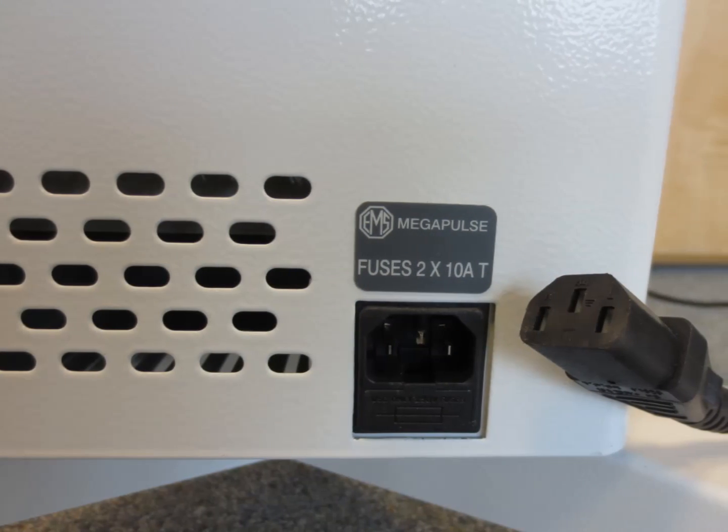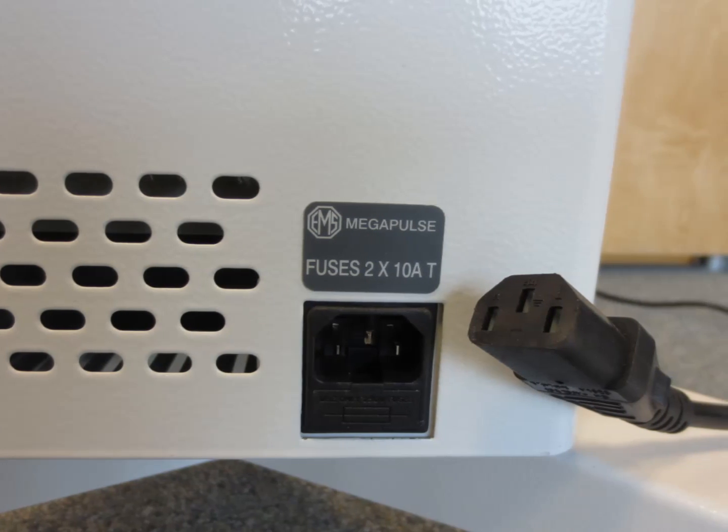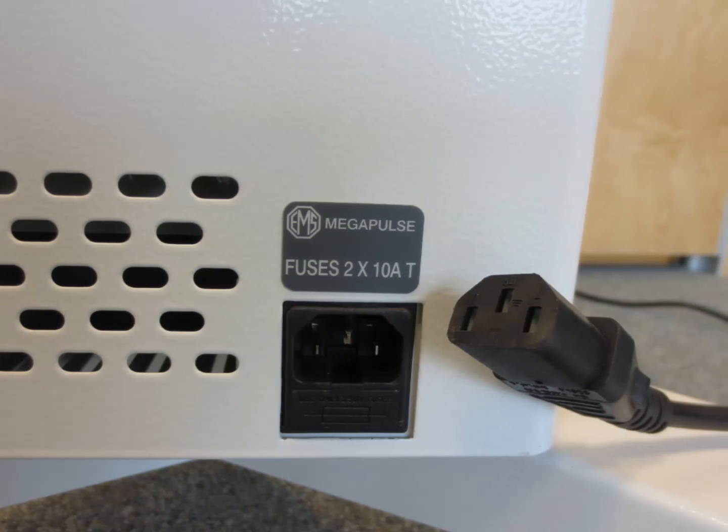As you might expect, it's only mains powered but has been designed so it can be used with any mains power around the world without modification.